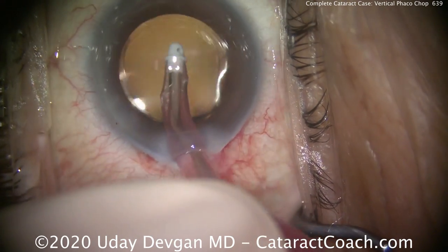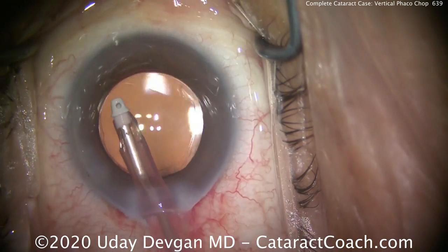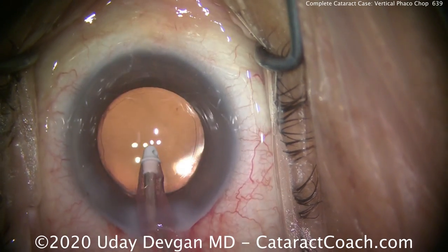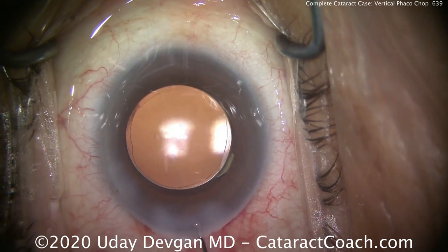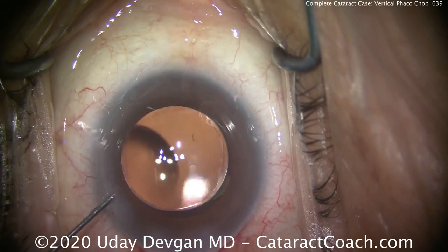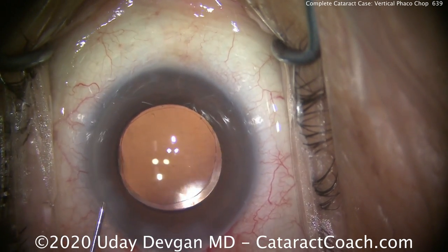You can see we've made nice short work of it. Everything went beautiful in this case. I hope you enjoy watching these complete cases — that's something new we've been doing here on CataractCoach for about the past year or so. Watching the complete case from start to finish really does give younger surgeons an idea of what is possible and what they should set their sights on doing. I have no doubt that many of you young surgeons will become true masters of this craft. I love the surgery — I'm sure you do too. Thanks so much for watching.